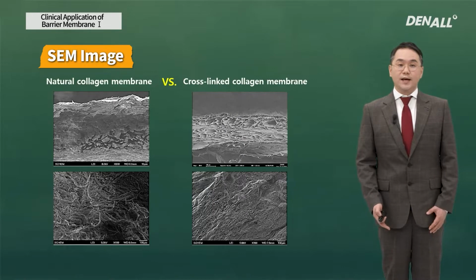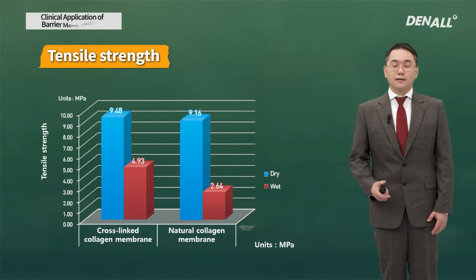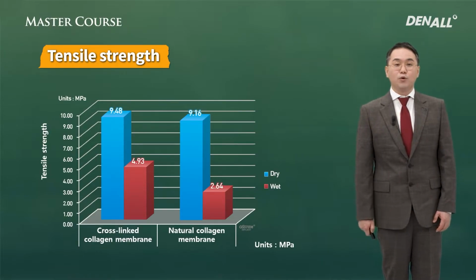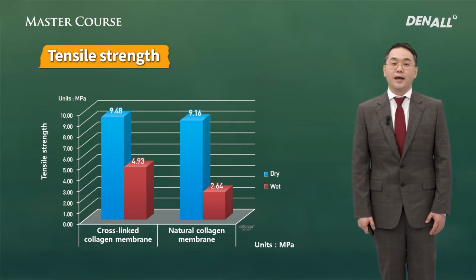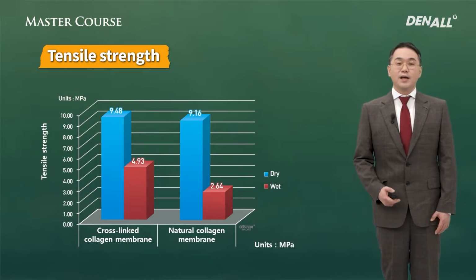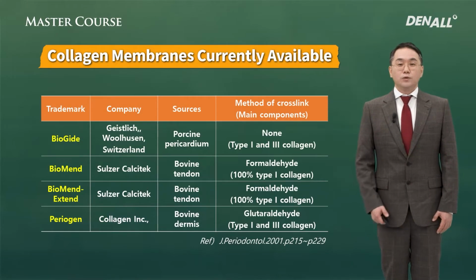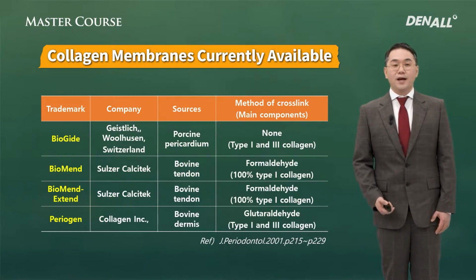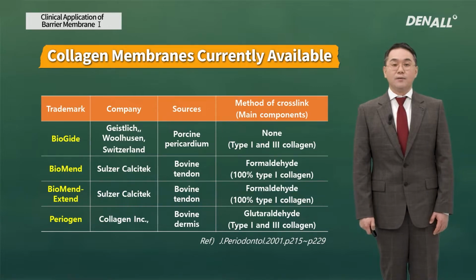During handling, it doesn't get torn apart easily. When it is wet, the tensile strength is much higher in the cross-linked collagen membrane. So when it is hydrated, clinically it is less broken and the resorption period can be lengthened. That is the advantage. Currently on the market, there are various cross-linked collagen membranes, and this is a study on the methods of cross-linking.